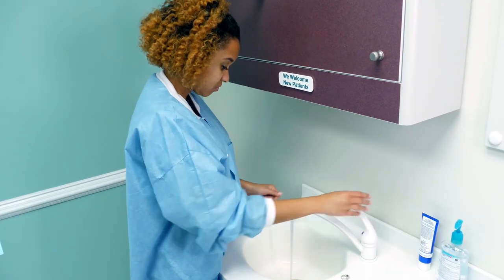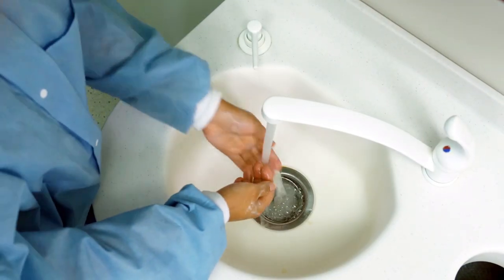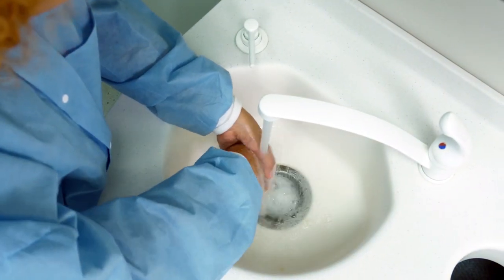Review the patient's medical and dental history, including any previous complications or changes since their last visit. Have the dentist review the dental chart and confirm the number and type of radiographs to be exposed. At the beginning of each day, prior to starting the procedure and after the completion of the procedure, wash your hands.